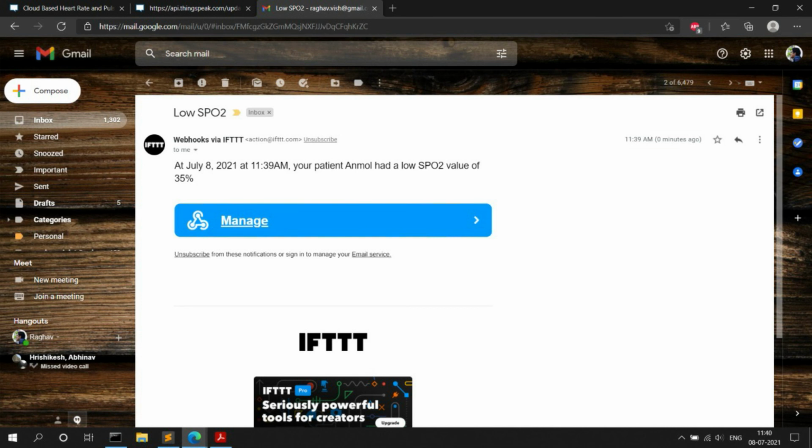So that concludes the demonstration of our project. We went over the mobile app, the dashboard, the email integration, as well as ThingSpeak, and how we sent the email using webhooks. Thank you very much.